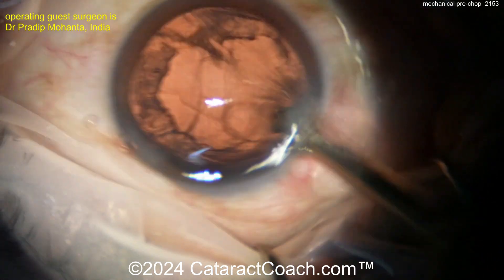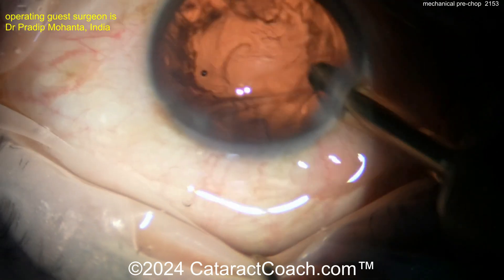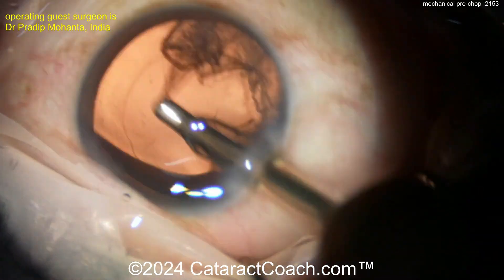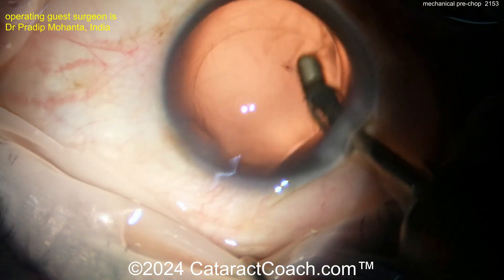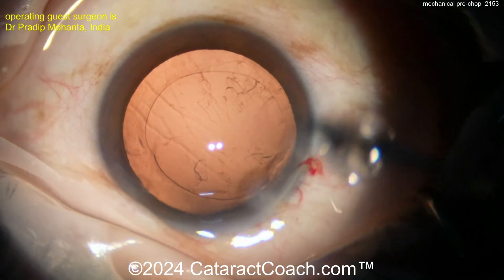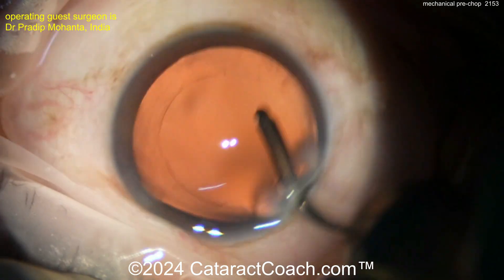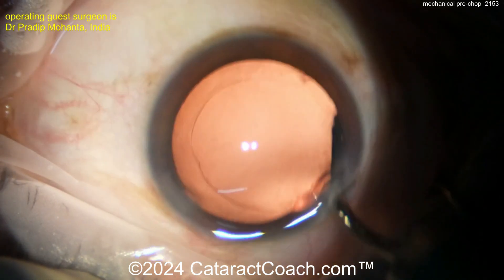A little coaxial irrigation-aspiration removes the lens cortex. Try a pre-chop technique — there are many different ways of doing it. On cataractcoach.com there's even a video of a resident case where just a chopper in one hand and a 27-gauge BSS cannula in the other is used to impale the nucleus, hook the equator, and chop it up. For a beginning resident, you might just chop the nucleus into four quadrants before they put the phaco probe in to make life easy.